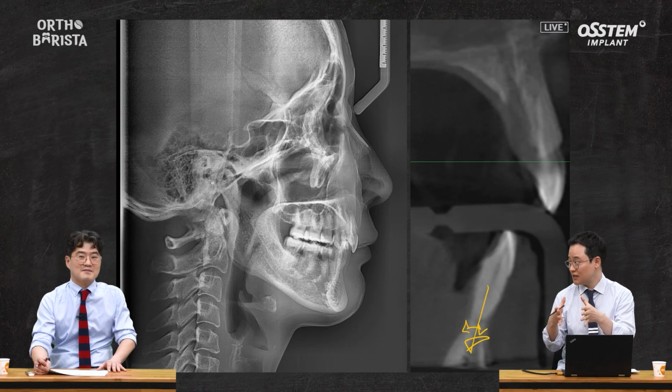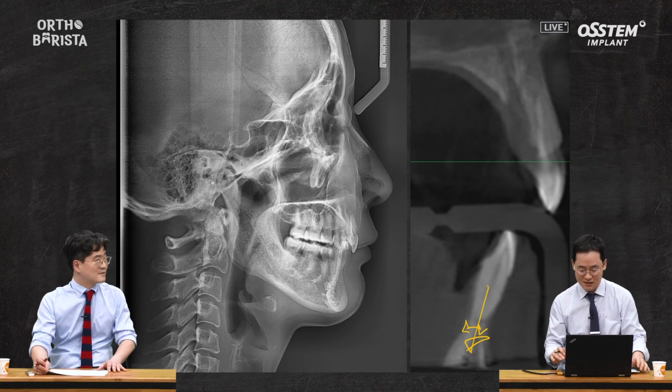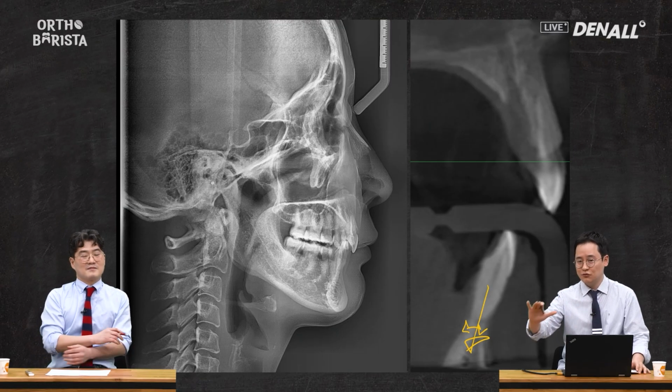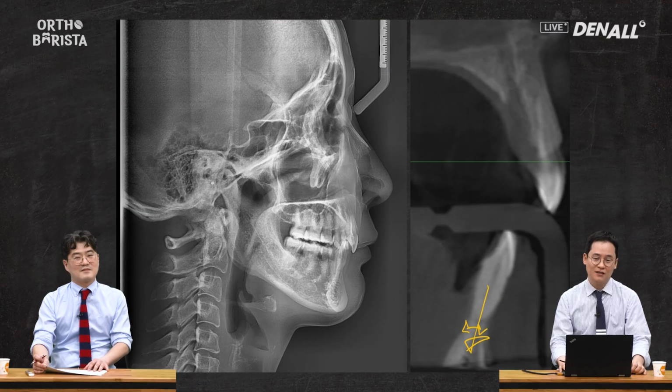The cases shown earlier had thicker bone structures, which made intrusion more feasible, though other factors might also have played a role. If the underlying issue isn't identified, even repeated submissions to the dental lab or clear aligner providers won't solve the problem. Therefore, verifying whether the conditions are suitable for intrusion is crucial. Doing so will greatly help in successfully applying clear aligners in clinical practice.